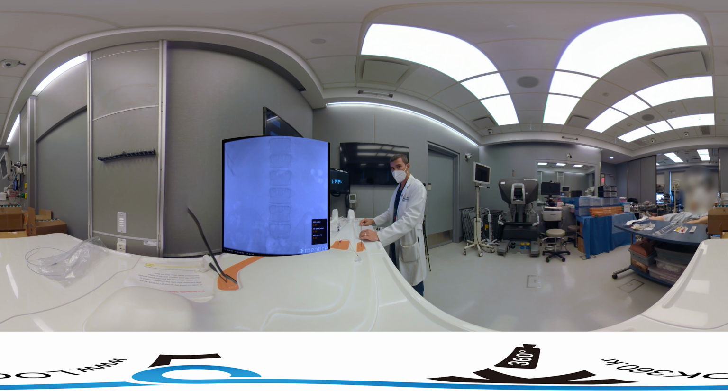For this part of the procedure, we're going to use the base catheter, which is a 5 French catheter. We're going to use a Cobra 2, or a C2 catheter, and then just a standard 035 wire. So we're going to introduce these into the patient. Again, we have right groin access with a 5 French sheath. I'm going to go ahead and introduce the catheter and now the wire. And now you're going to see both items come up on the screen.